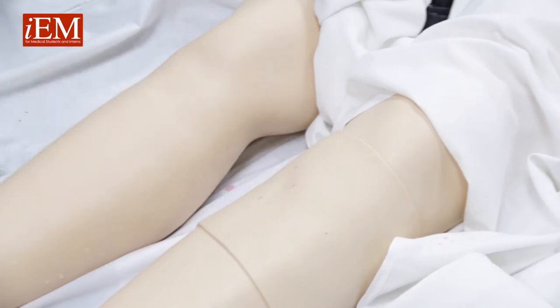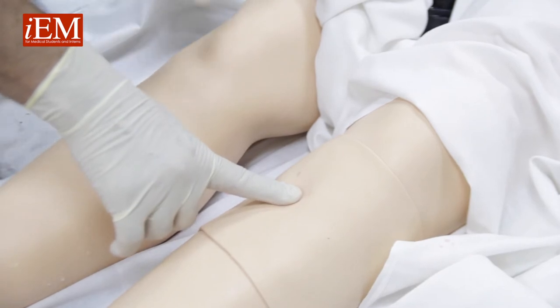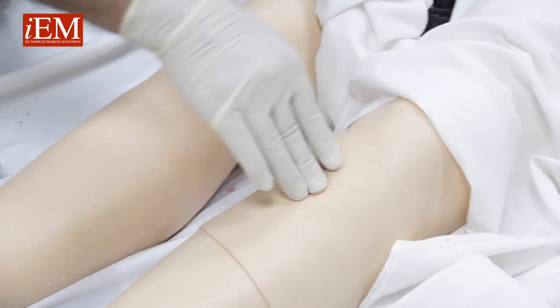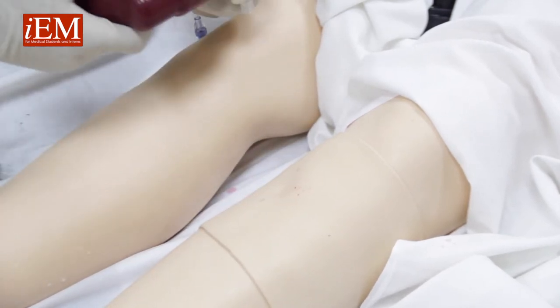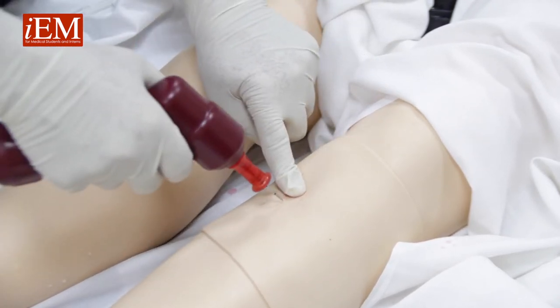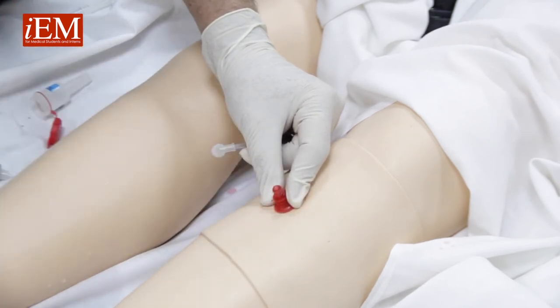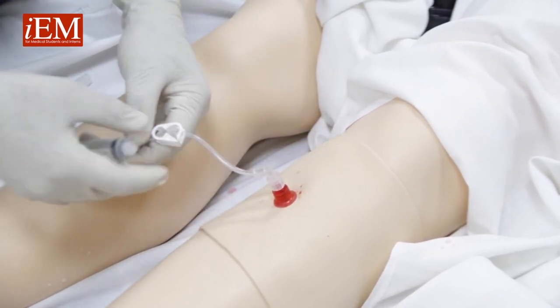Now we're going to show you how to insert an intraosseous needle. First, identify your anterior tuberosity, then go down two to three centimeters. Open your intraosseous needle, take your drill — it's connected — and once you know your anatomy, go straight down. Hold it, unscrew the needle, and connect your tubing.